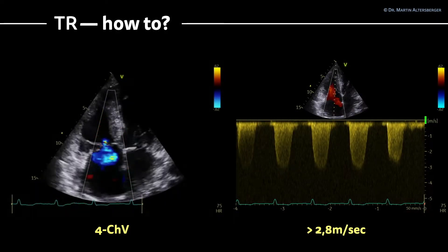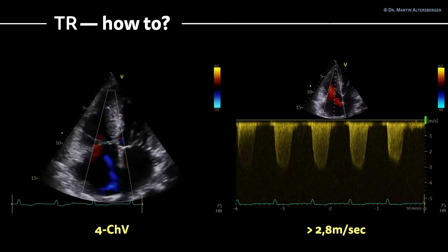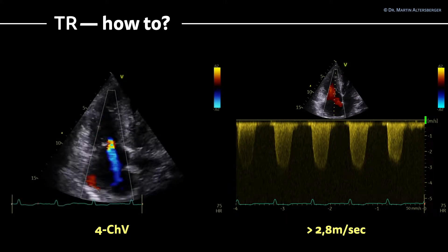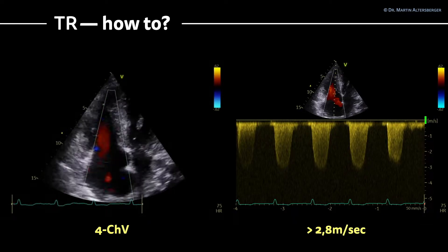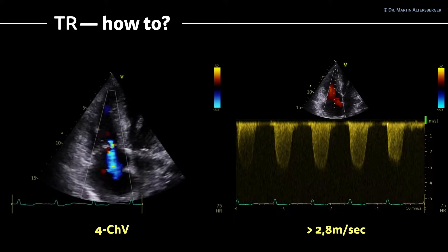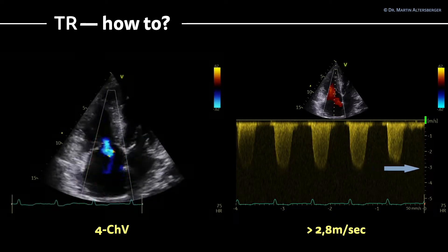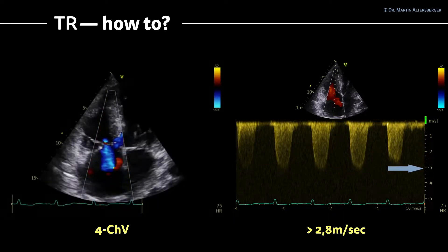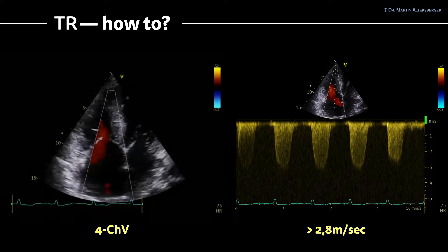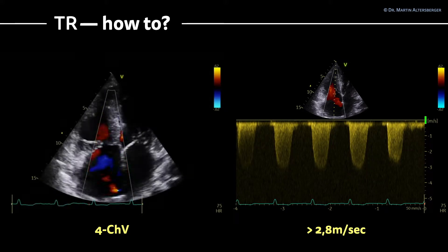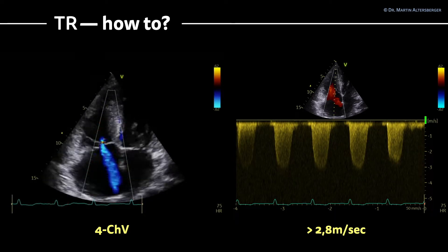Now we have to see how to measure tricuspid regurgitation. For the four-chamber view, we use color Doppler to guide the placement, then measure the peak signal of the tricuspid regurgitation with continuous wave Doppler. This is approximately 3.1 meters per second — definitely above 2.8 m/s, which favors an elevation in pulmonary arterial pressure and is a positive marker for diastolic dysfunction.